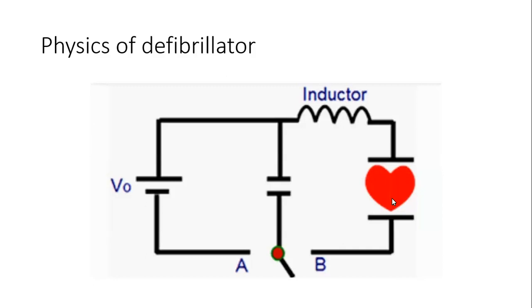That is, all it's going to do is depolarize the heart. Whether it depolarizes the heart during the T wave, which will cause an arrhythmia, or during the R wave, which will then cardiovert the heart. Quite important. All right, I think that was our last one.